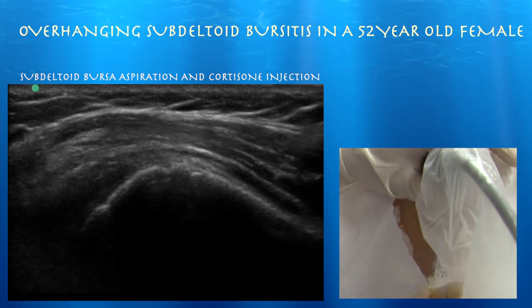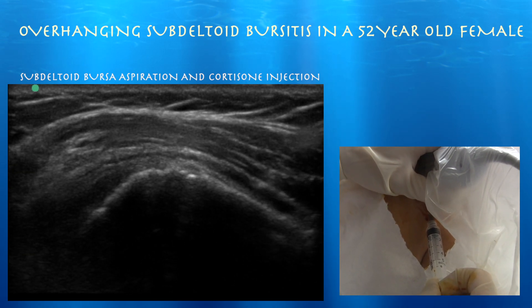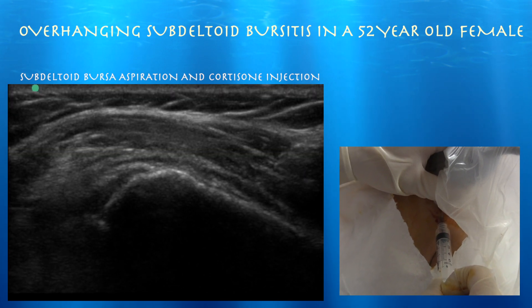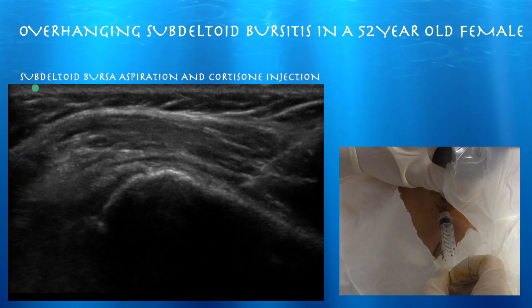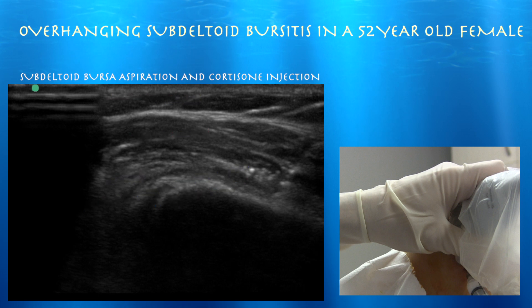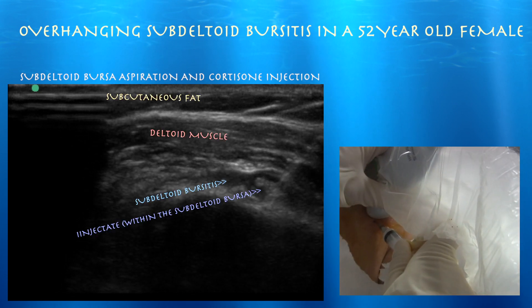We're just trying to get that bursa — to see if we can get any fluid out of it. We actually are getting some fluid out — we got a little bit of fluid out of this bursa. It's a really easy target since it is the subdeltoid bursa, so all you need to do is get the needle in there. You're not even near the supraspinatus tendon, so there's less chance for any kind of injury during the procedure, and it's quite an easy target to hit. Here's the initial injectate, which was a little bit superficial to the bursa, and then we advanced the needle further and were within the subdeltoid bursa itself for the remaining part of the injection.